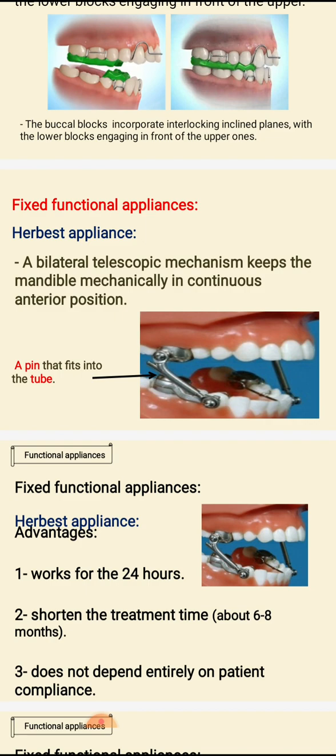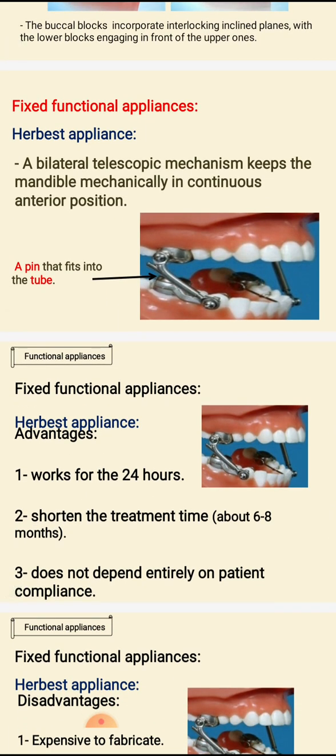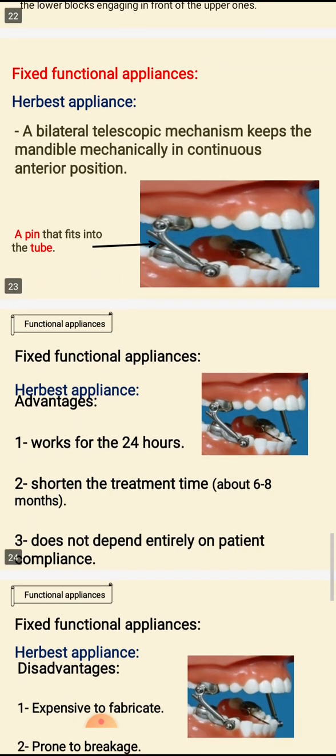Fixed functional appliances in general have their advantages. These advantages include that the appliance works for 24 hours. It's always there. Because of this, it does not depend entirely on patient cooperation, as is the case with the removable functional appliances. This is one advantage.